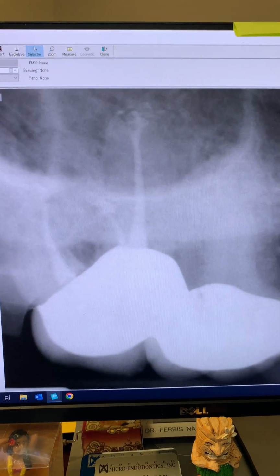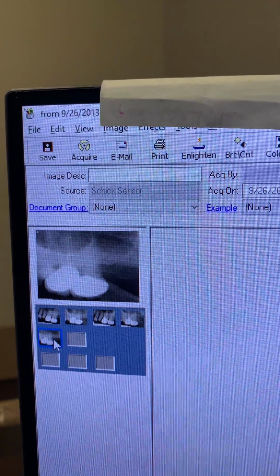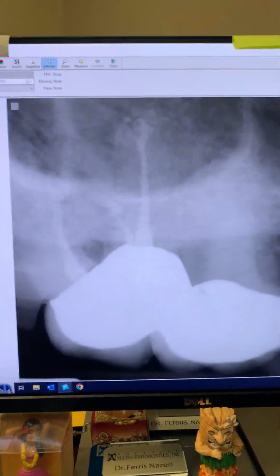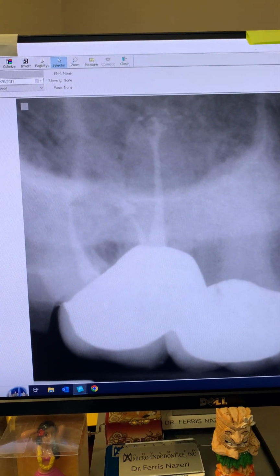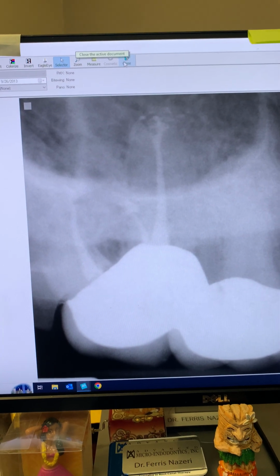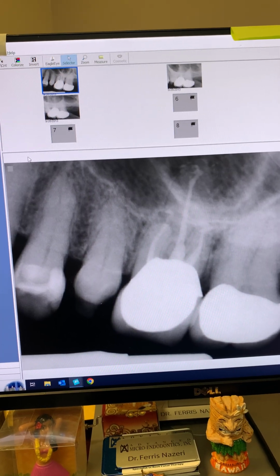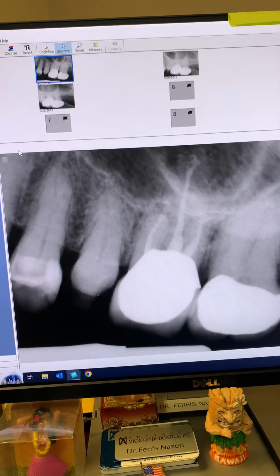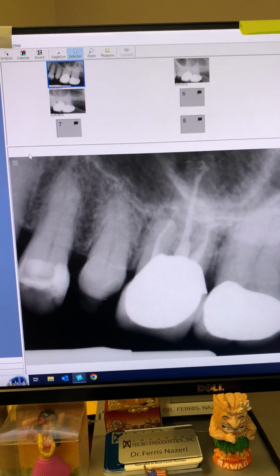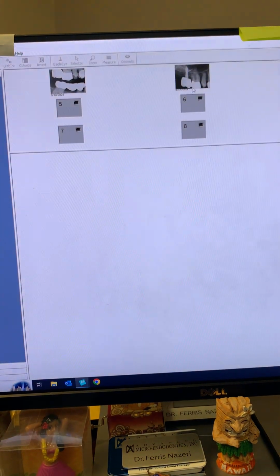All right, so you can see, again, look at that lucency there as well. And here's the date, as you can see, 11 years ago. Suddenly, out of nowhere, the patient came back to see me for a bunch of different teeth. She is 94 years old now. Beautiful, beautiful 94-year-old lady. I mean, beautiful, really. I told her, you're so... She dressed up so beautifully and had makeup on. And so we took a couple of PAs of tooth number 14. I just wanted to see how the tooth was doing.